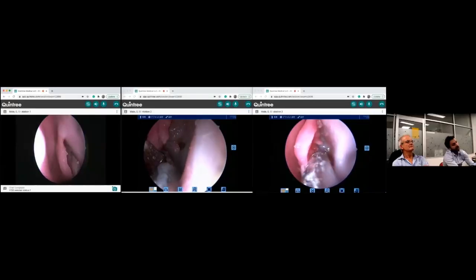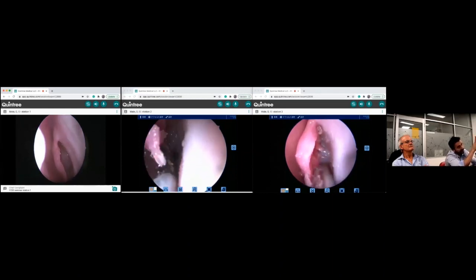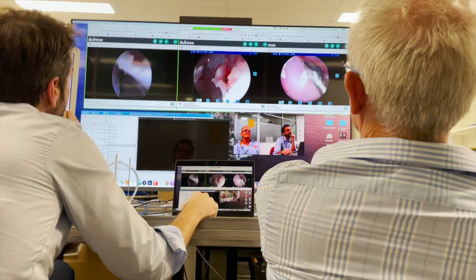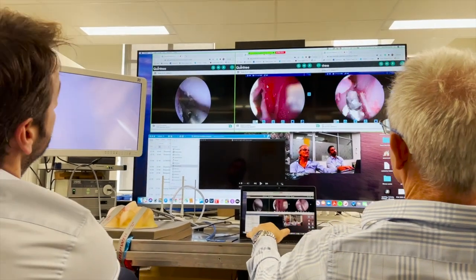Each dissector is watched on the screen from Adelaide and gets individual instruction as to what and how they should proceed with the dissection. This is constant observation, supervision and instruction.